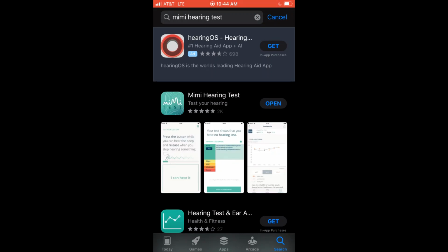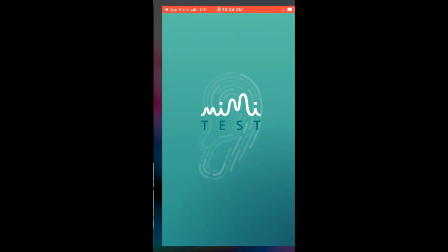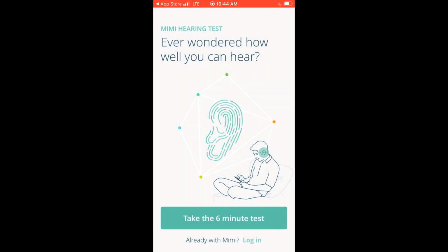It will take you to the Mimi hearing test main application page. This is where you can download it and get some more information. Once it's done downloading, press open, and this is what you'll see. So you'll press take 6-minute test.